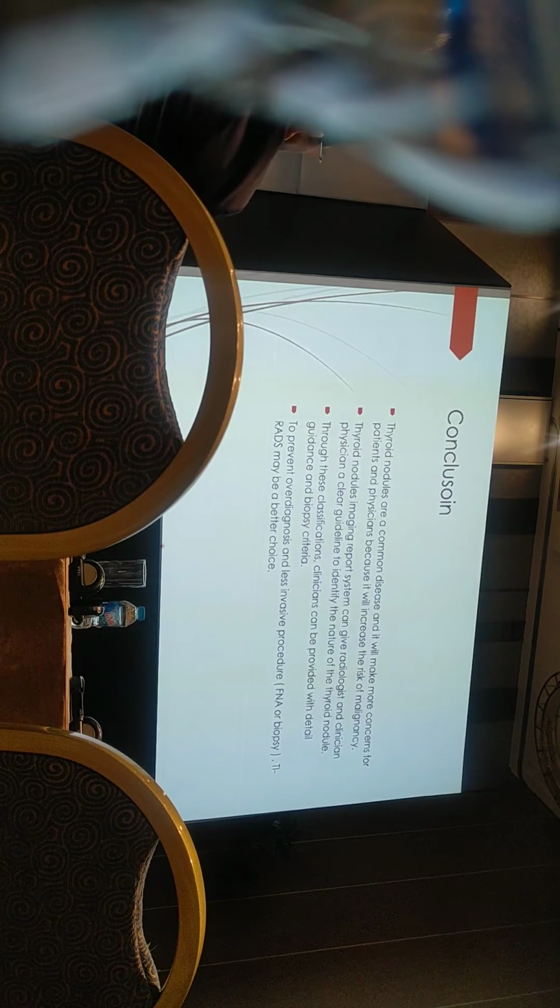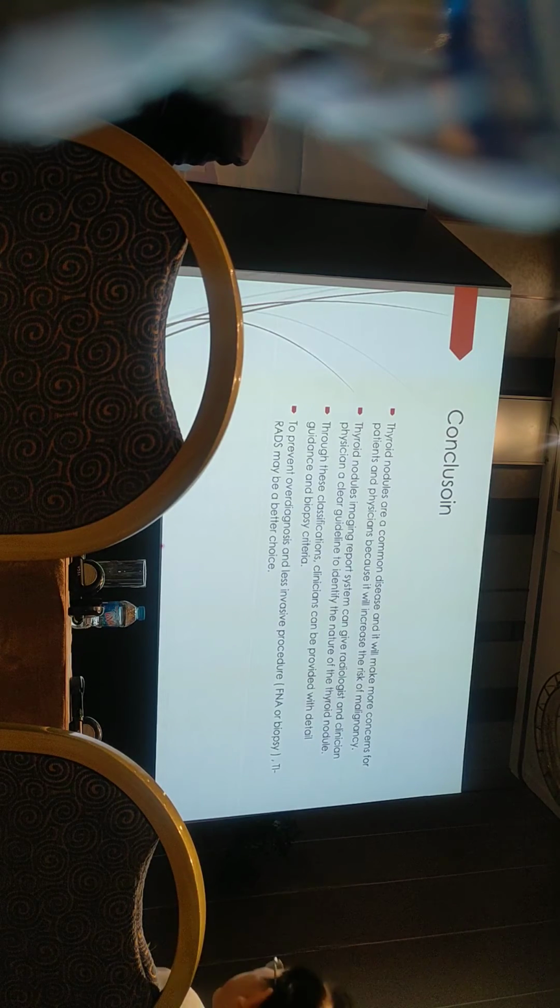So, in summary, thyroid nodule is a common disease. It also raises more concern for the patient and physician because it increases the risk of malignancy. The thyroid nodule reporting system can give radiologists and clinical physicians key guidelines to identify the nature of the thyroid nodule. Through this classification, clinical physicians are also provided more detailed guidelines on when to perform a biopsy.